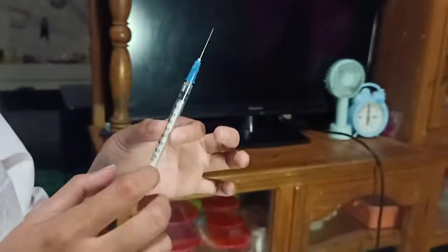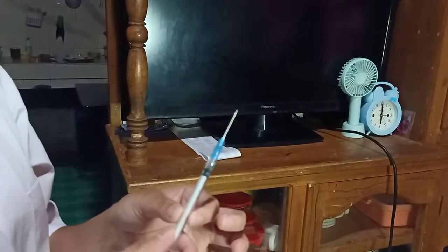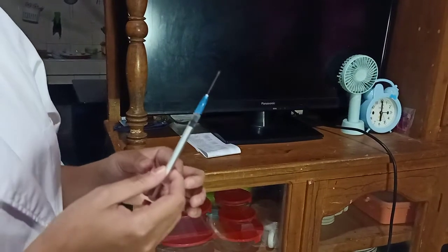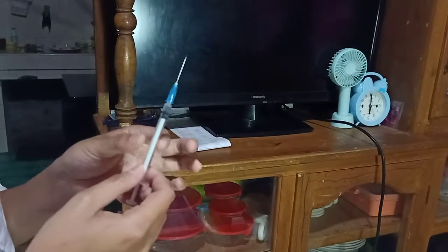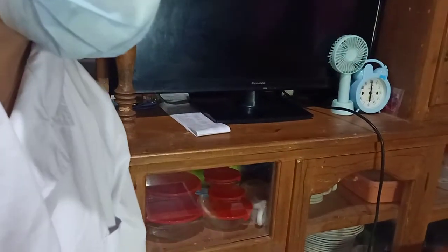And now we have to remove the aspirating needle and replace it with the right size needle that will be used for the actual administration of the medication.